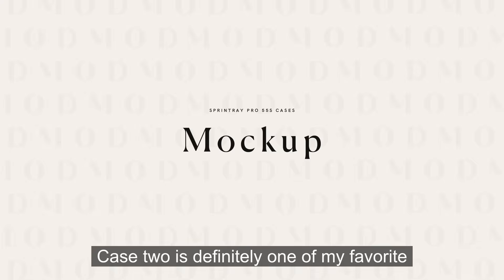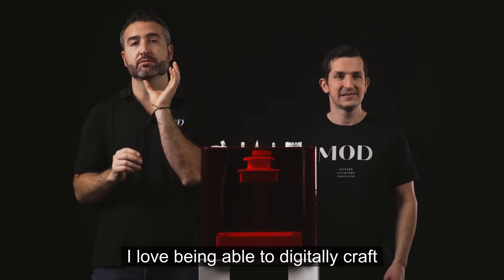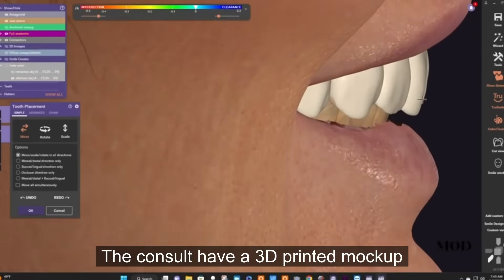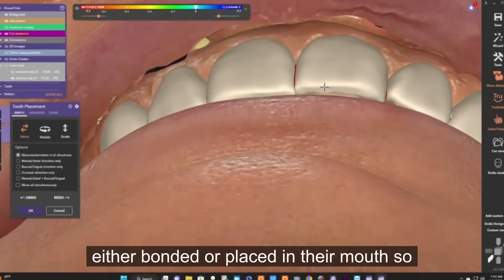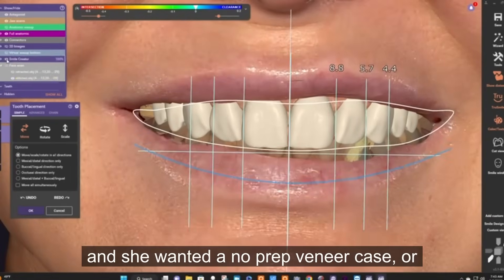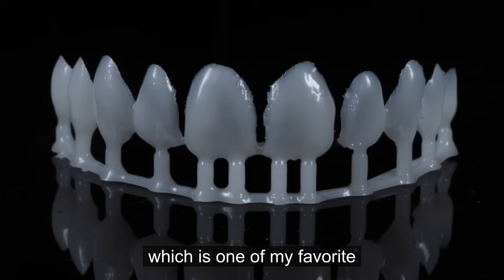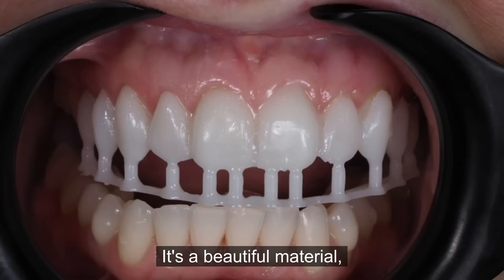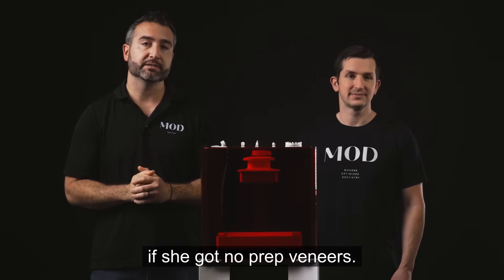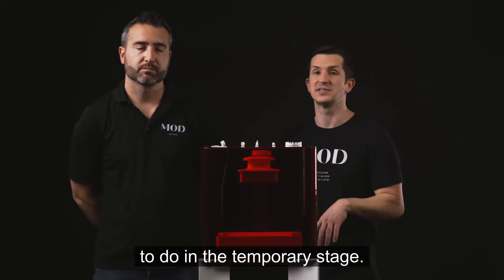Case two is definitely one of my favorite things to do clinically with any 3D printer, and that is mock-ups. I love being able to digitally craft the patient's smile and have them, in the very same appointment they come in for the consult, try a 3D printed mock-up so they can see in real time exactly what their new smile could look like. This patient wanted a no-prep veneer case. We used Onyx Tough in Hollywood bleach — a beautiful material — and in a short 2-hour appointment we were able to show the patient what no-prep veneers would look like. Not only has this helped our case acceptance, it also cuts down on refinements needed in the temporary stage.